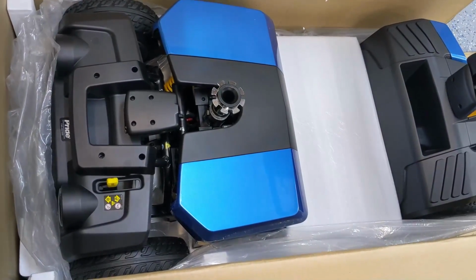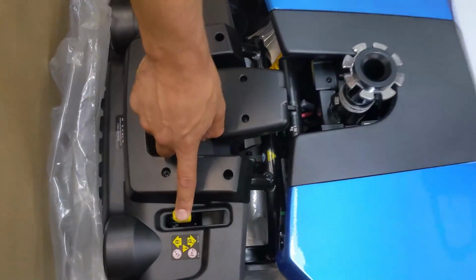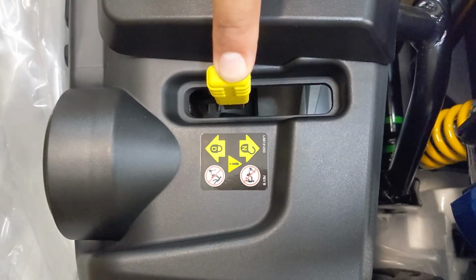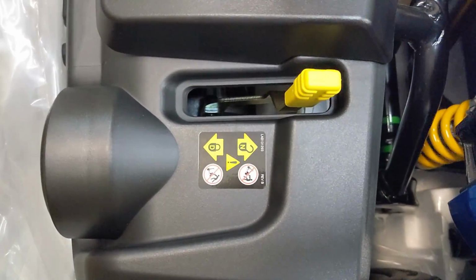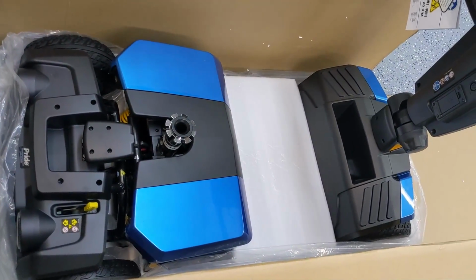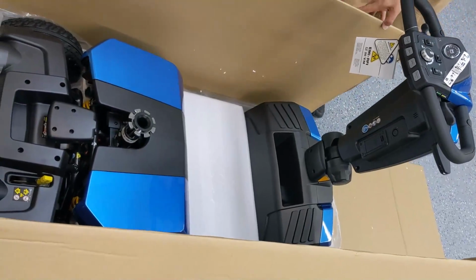Now, in order to push the scooter and have it be in freewheel mode, you have to unlock the brakes. Drive mode is the way it should be if you want to use the scooter with the batteries on, as intended. If the batteries die for whatever reason and you need to push it manually, you put it into neutral mode. In this case, the batteries and the keys are not installed. We need to move it without using the battery, so we've pushed it into neutral mode.